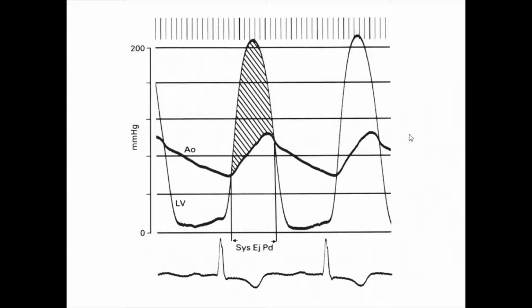If I ask you, is it normal to have a systolic gradient between LV and aorta or abnormal? It's abnormal, because both LV and aorta systolic pressure is around 120. So if I have a systolic gradient between LV and aorta, what does this go with, which diagnosis? Aortic stenosis. And in hemodynamics we usually have a peak-to-peak gradient or peak instantaneous gradient.